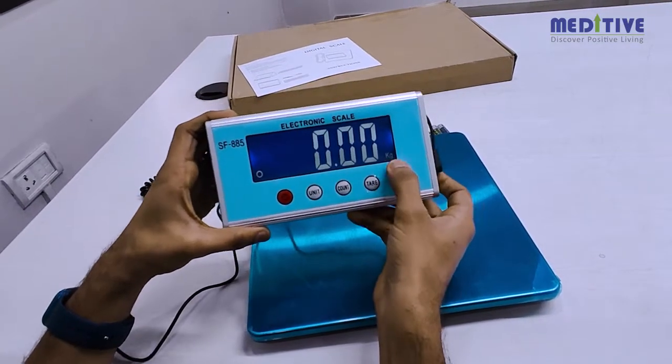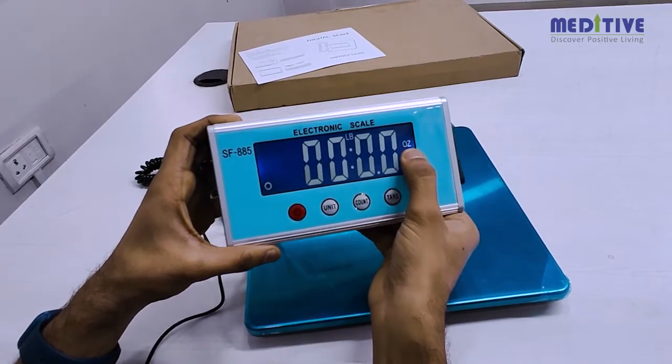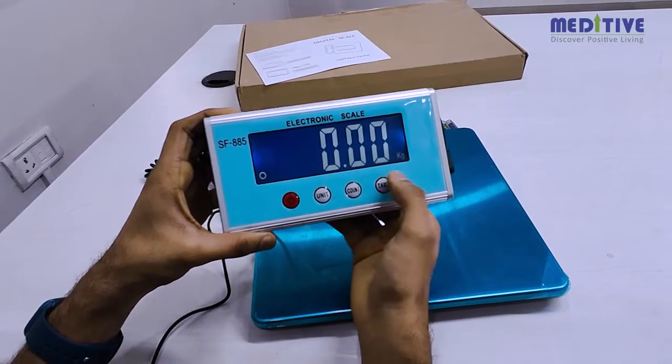There are three units of measurement — kilogram, pound, and ounce — which can be selected using the unit button. Make sure you have selected the kilogram option.